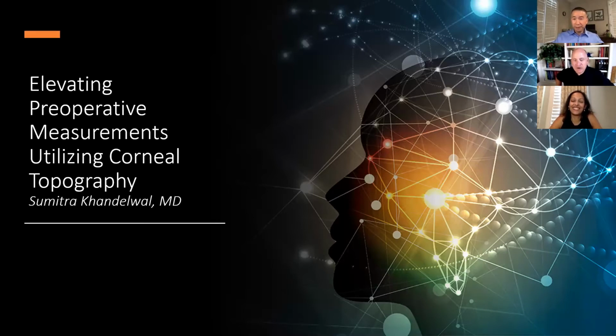Yeah, you gave some great pearls there. Just a quick thing. I have noticed it's been a couple years since my practice made the change to the 700 from the previous biometer, the 500. And I can't remember the last time we've had a case where we couldn't get a scan. Previously with the 500, we had more dense cataracts, especially dense cortical cataracts. It was sometimes difficult to get a scan at all. I had to do immersion. Tell us about your experience on that as well.